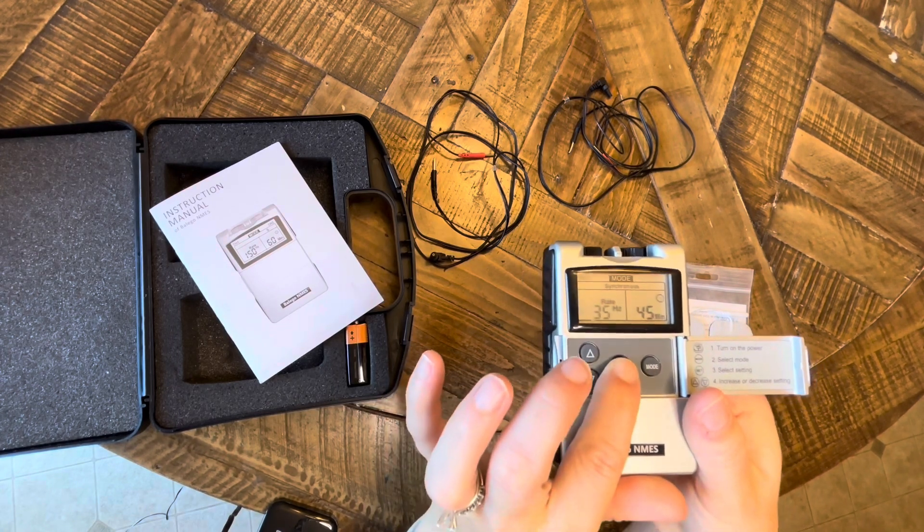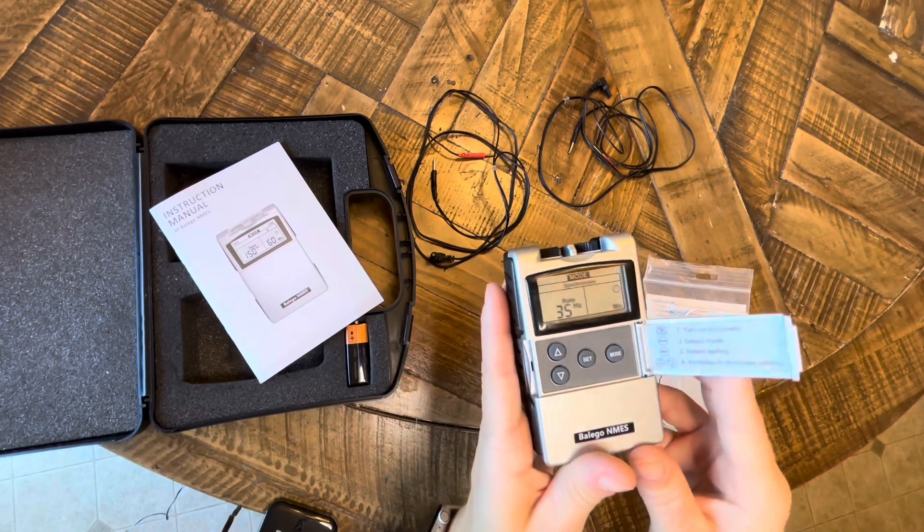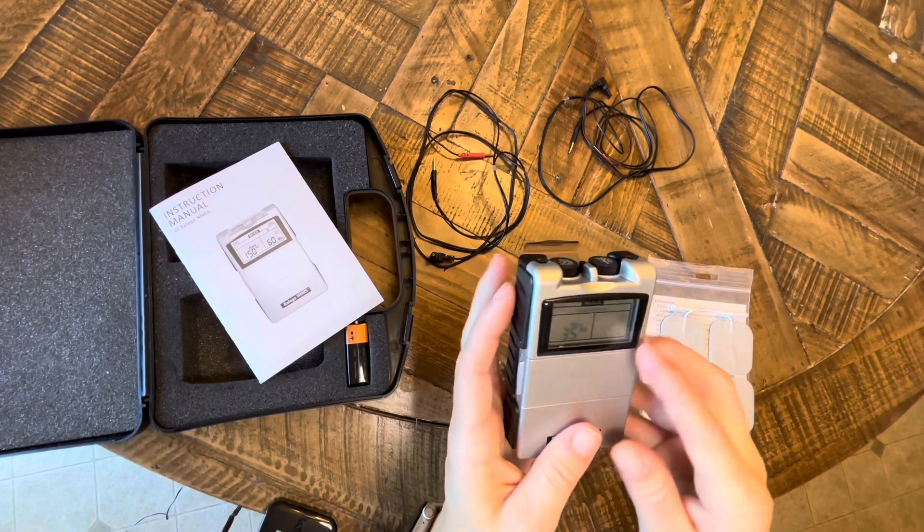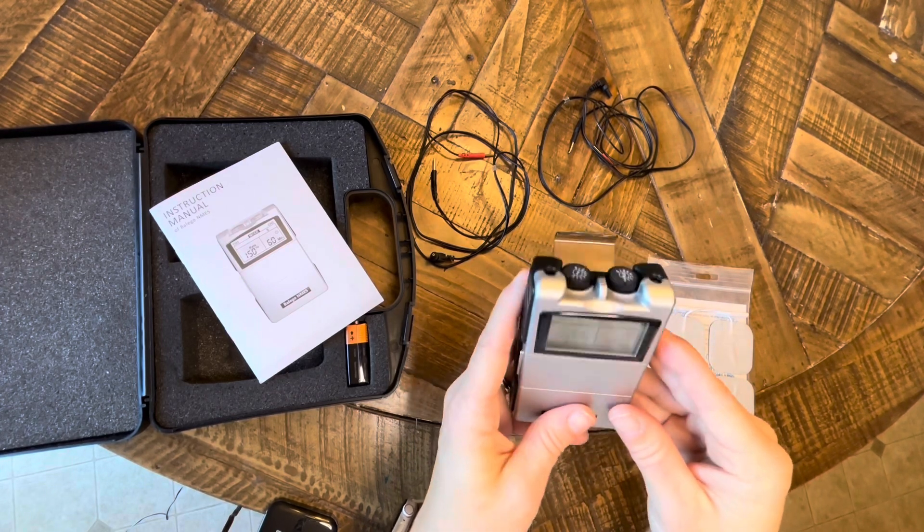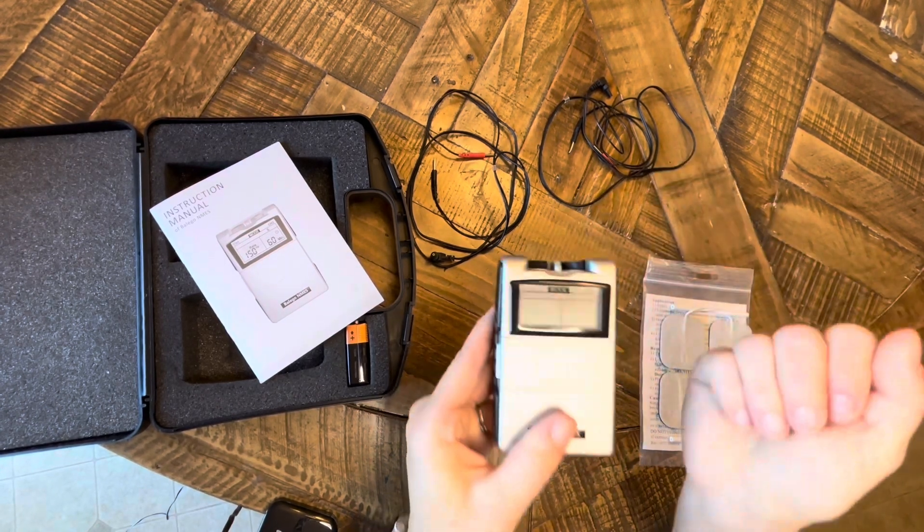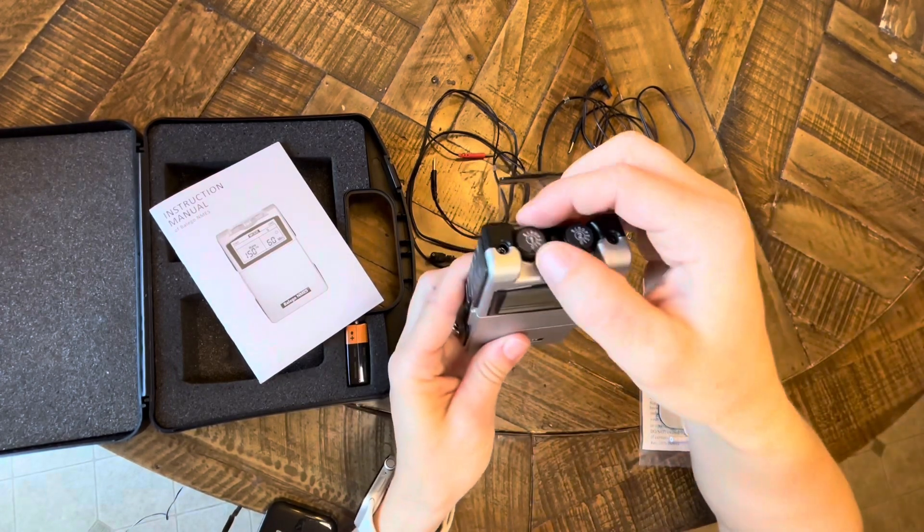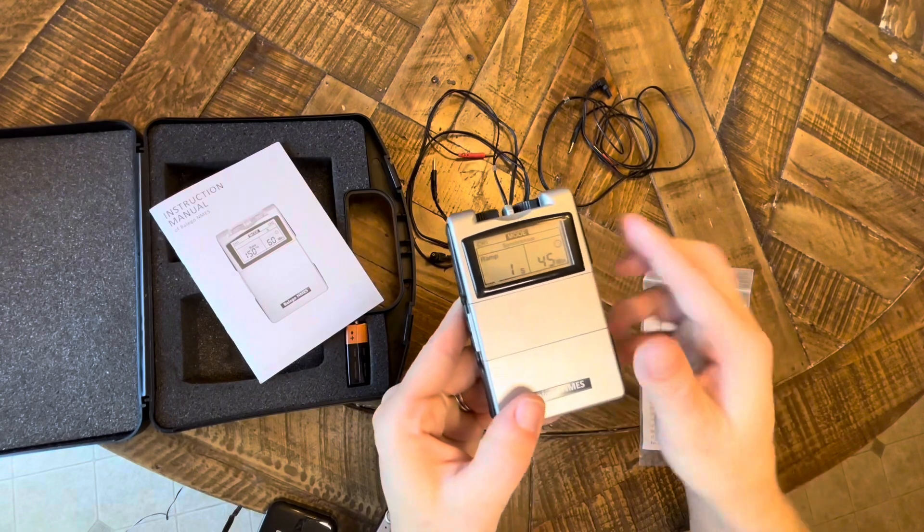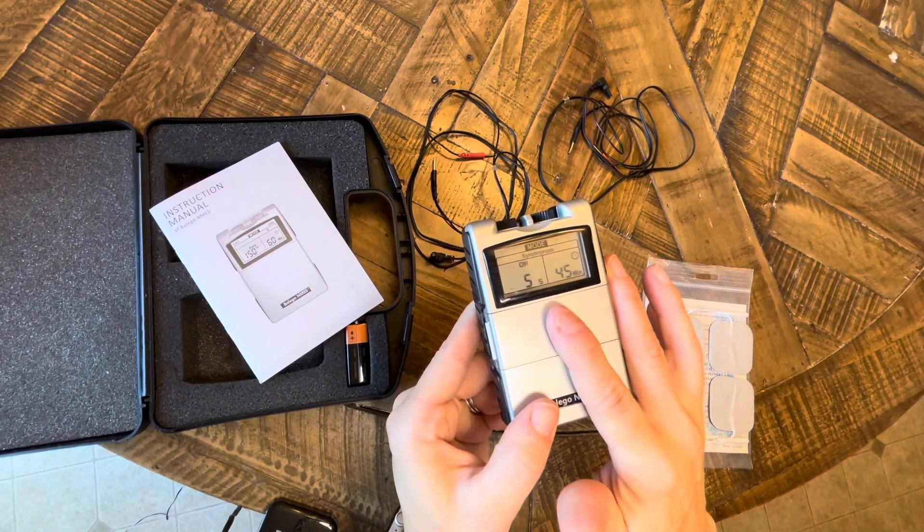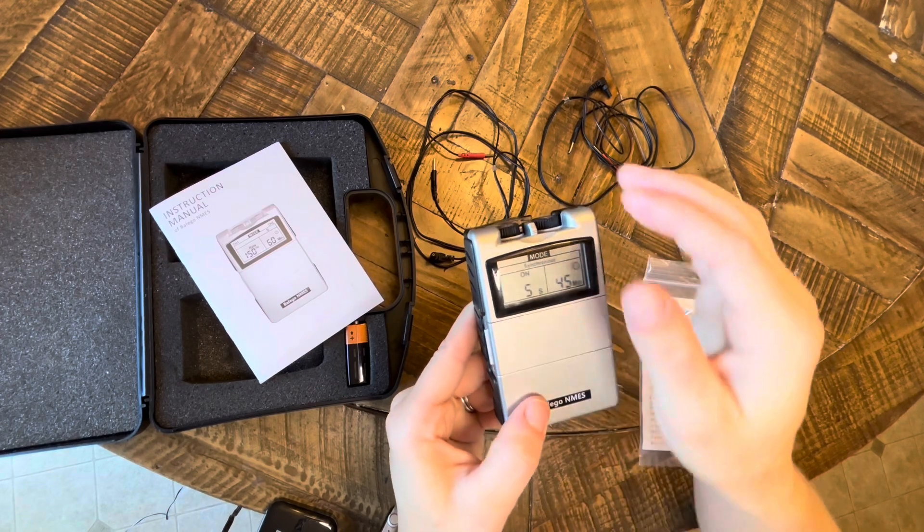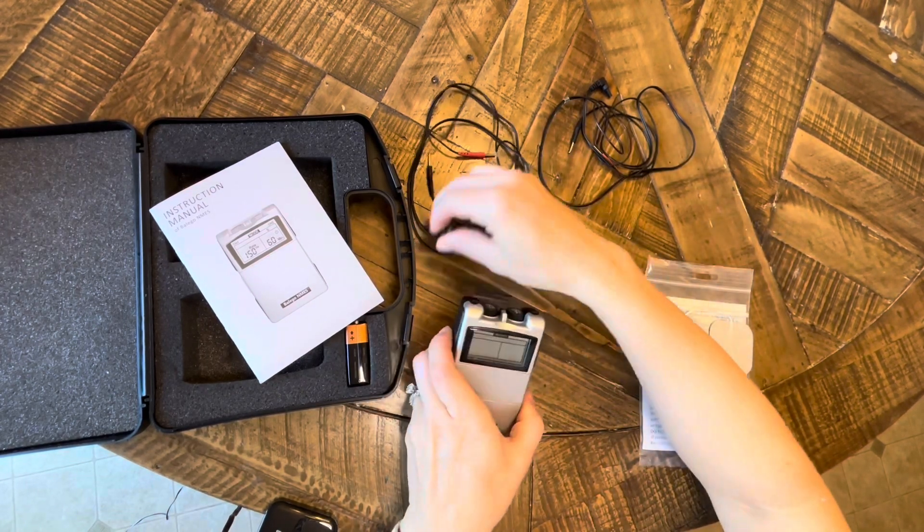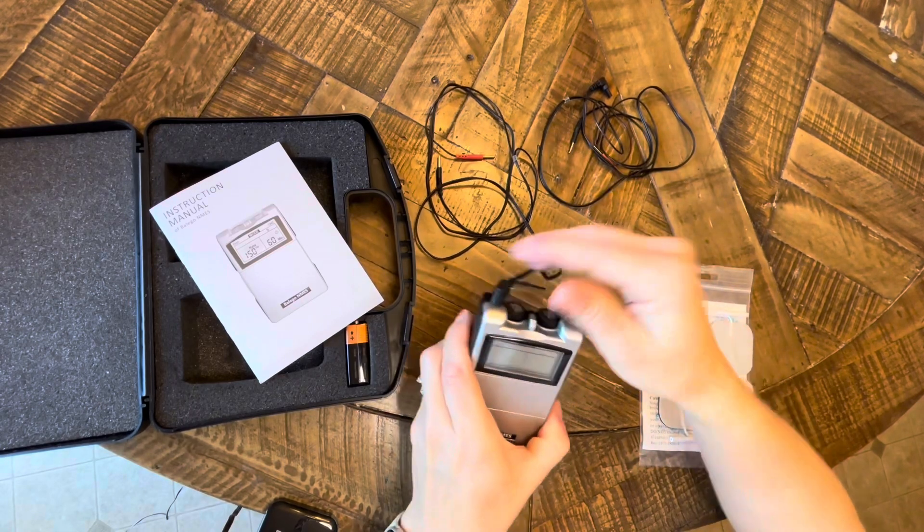And then for pulse width, for the Belego the maximal pulse width is 300, so I usually leave it at that. 250 to 350 is typical for the upper extremity stroke rehab. And then the pulse rate can go up to 50 or 55 on this unit, and for upper extremity stroke rehab is usually around 35.